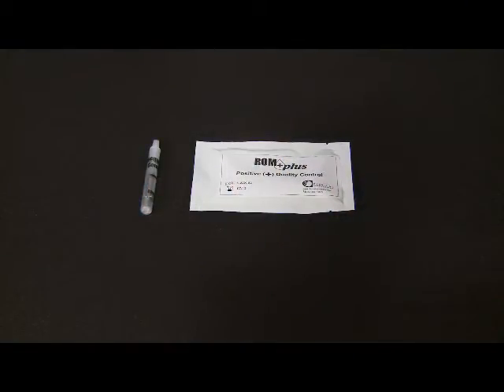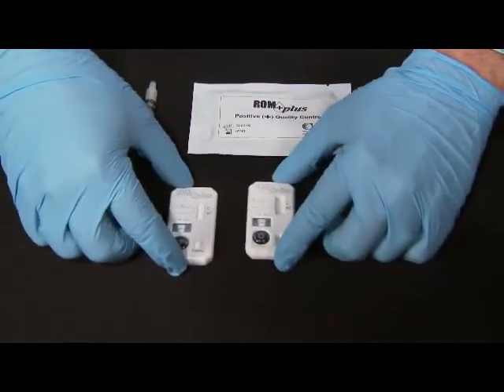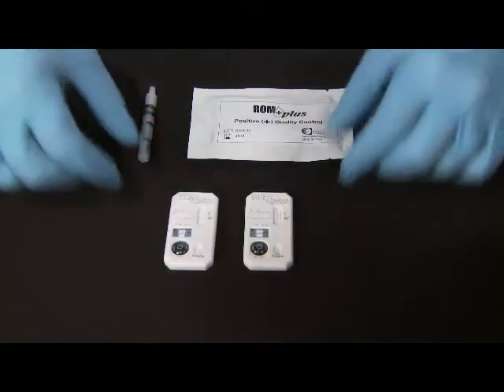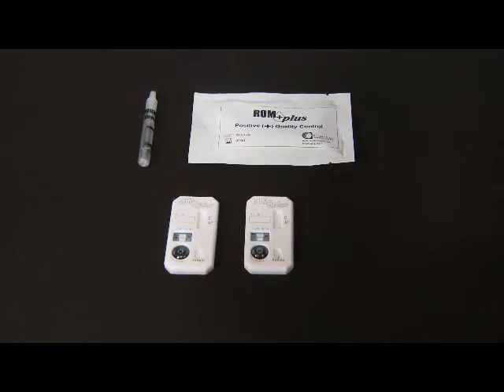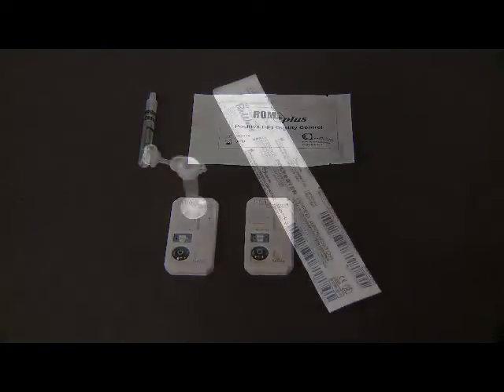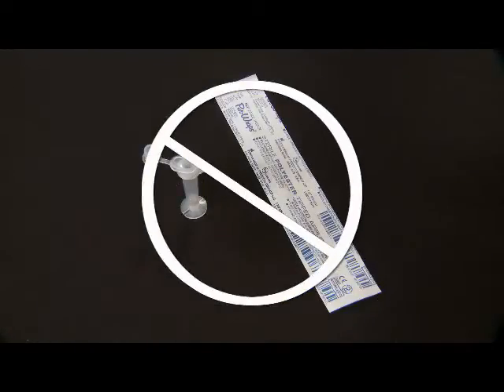To perform the quality control test, prepare two ROM Plus cassettes, one for the positive control and the other for the negative control. Since this is a quality control test and a human sample is not required, the vaginal swab and standard dropper vial from the ROM Plus test kit should not be used.